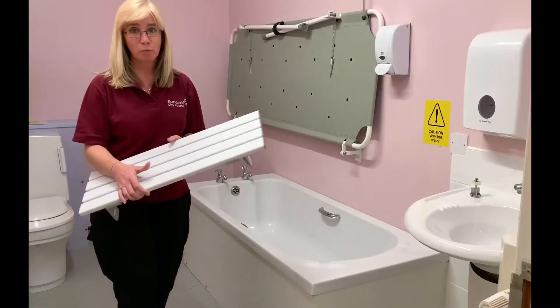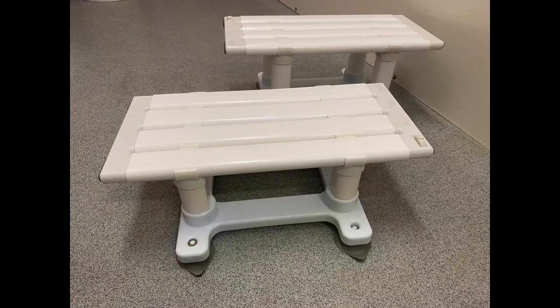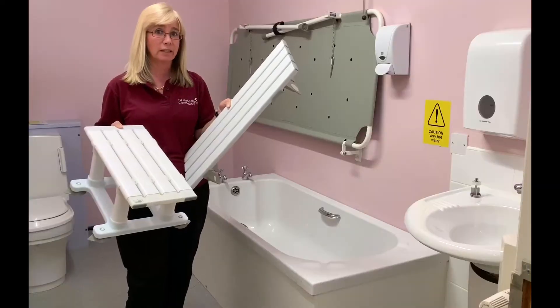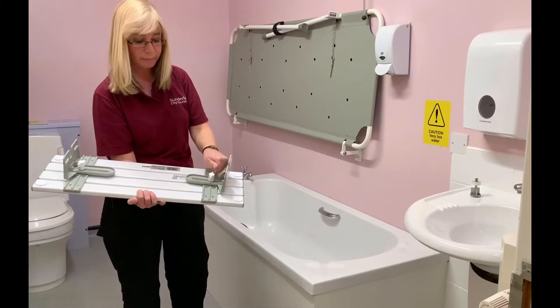This is a 26-inch bath board, and this, along with a bath seat, is fitted to people's baths to enable them to access their facilities in a safe manner. The 26-inch bath board can be adjusted.